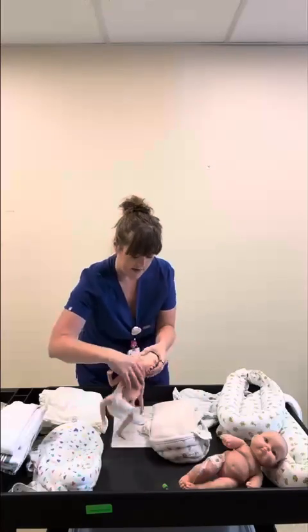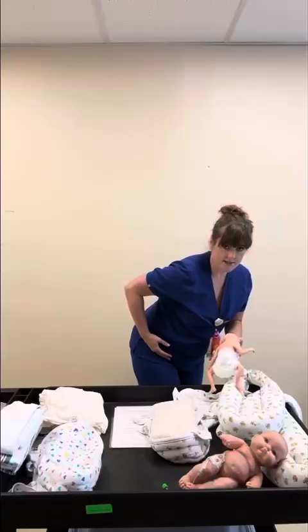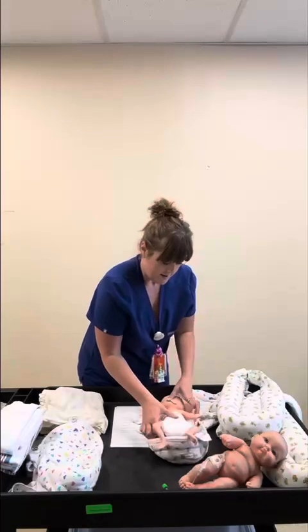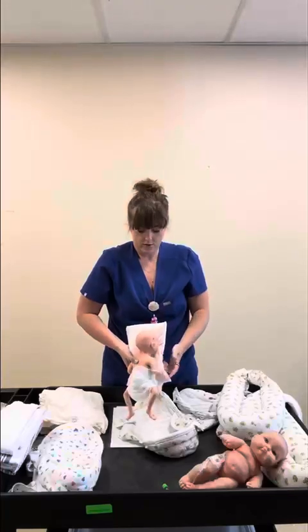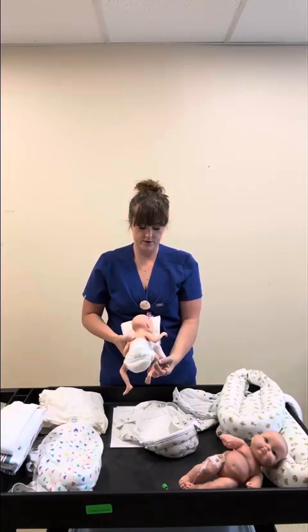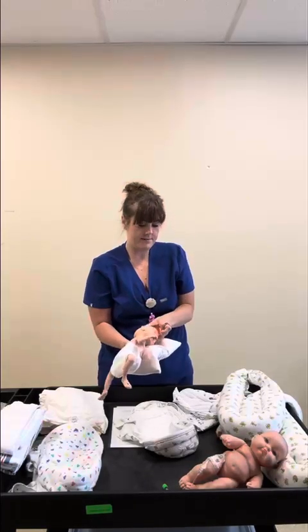So prone positioning with the Z-flow, you can either use the bottom half, so you want their hips, kind of belly button line, to be at the end so that they're midline and center still and in a flexed position. So I'm not using the whole top half because my baby's hips end right here and then my knees are bent under here this way. If I need to create a little tunnel for whatever here, I can do that.